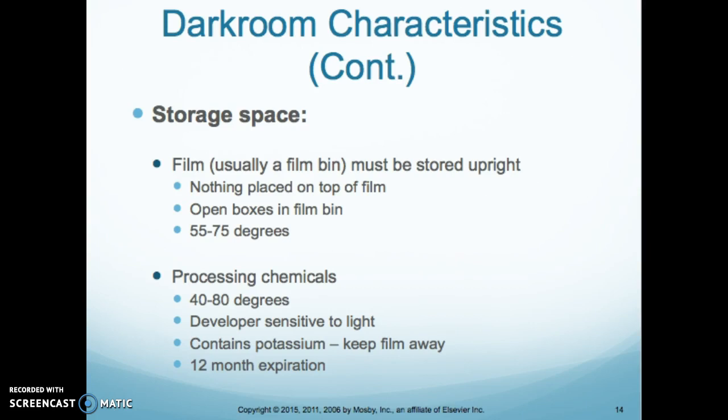So, storage space. Film is usually in a film bin and it's stored upright. That's how you want to store all film. If it's not in a film bin, it's going to be in boxes that are standing up. If you lay them down and stack them on top of each other, you're going to get pressure marks and you're going to have to throw away your box of film.